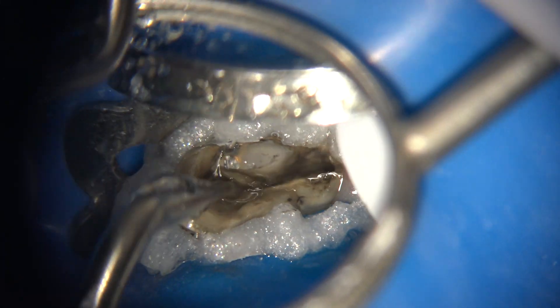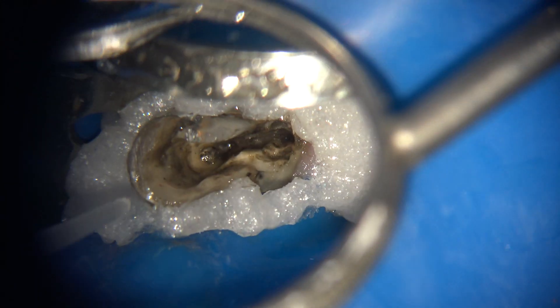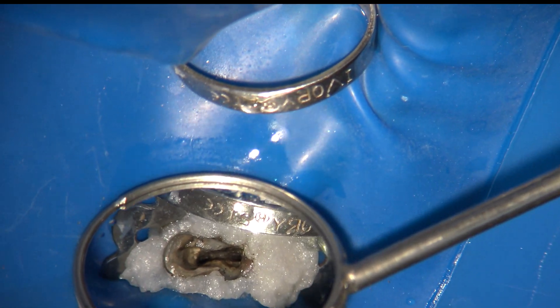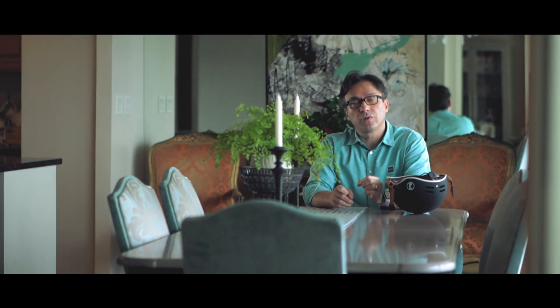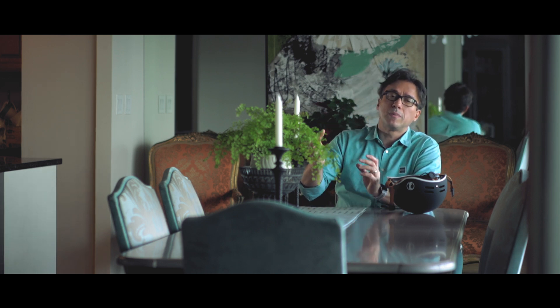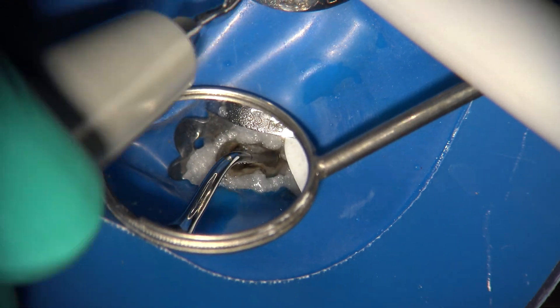We then proceeded to do the same thing for the palatal silver point — removing a little more dentin and using the same grabbing instrument. With the palatal silver point, it just kind of broke off and fell out once engaged. Once both silver points are removed, the key is to not go all the way to the apex right away, because there are corrosion products left on the canal walls. If you instrument aggressively down to the apex immediately, you risk pushing corrosion products out apically, causing significant post-op pain.